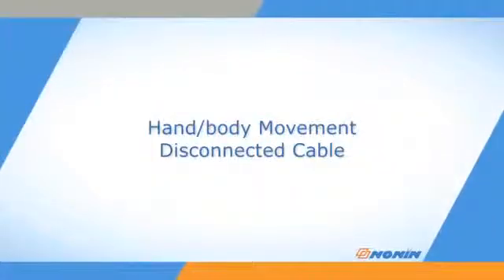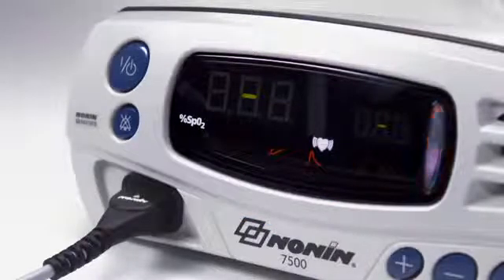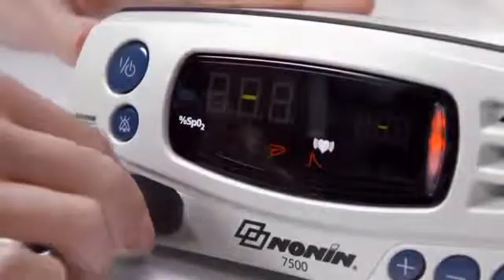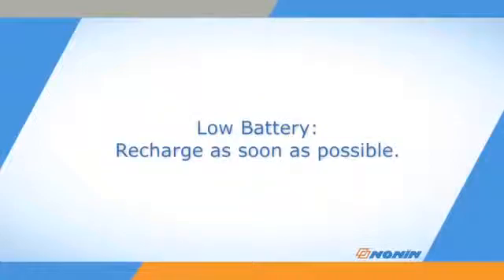Signal loss from the sensor is possible with hand or body movement or disconnection of the cable. A sensor icon will appear on the screen and the oximeter will alarm if this occurs. Signal can also be reduced by body position or cold conditions, which may reduce blood flow. Check and correct the position of the sensor if it has moved, and recheck the sensor connection to the oximeter. The low battery indicator will blink when the battery is getting low and stay on continuously when critically low. Recharge the battery as soon as possible.